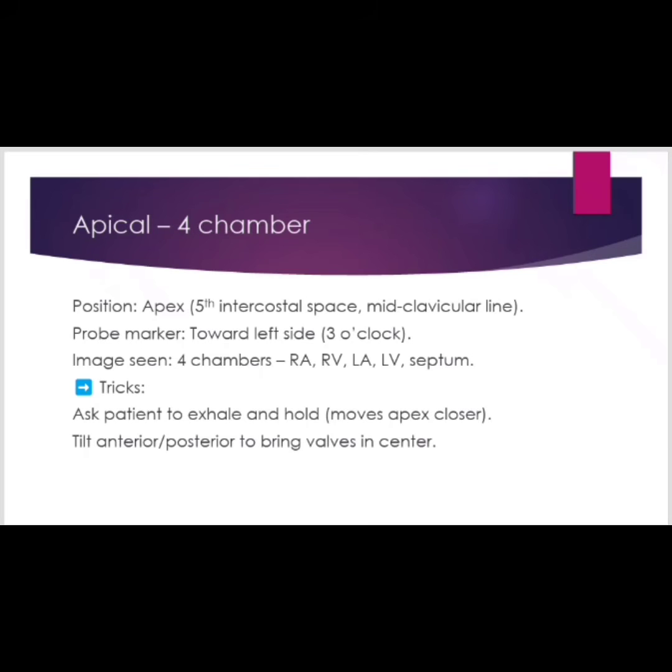Simple tricks to get a perfect A4C view. Ask the patient to exhale and hold. By doing this, the apex will get closer and it reduces LV foreshortening. Tilt the probe anterior or posterior to bring the atrioventricular valve to the center.